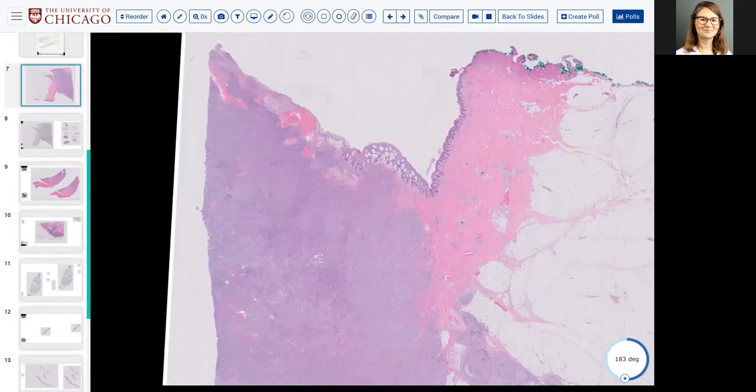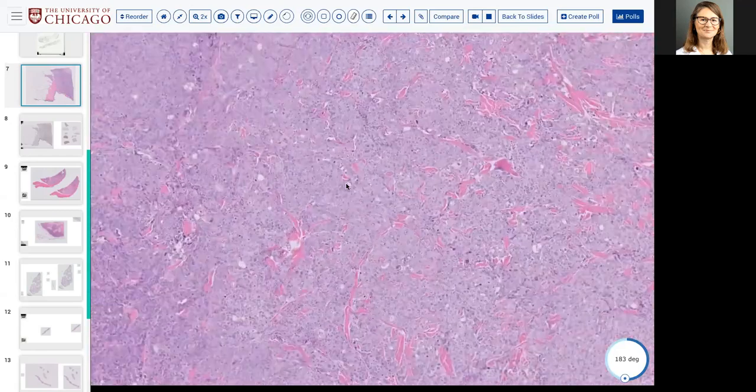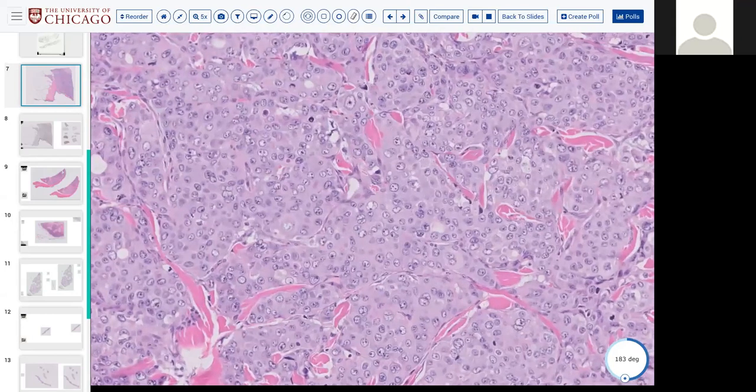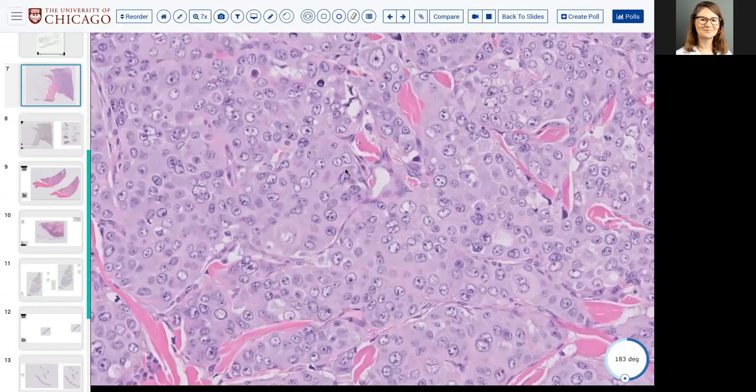Tell me what stains you want, and I'll tell you. We want to do vascular and INI1 and BRG. Okay, so vascular markers are negative, and INI and BRG. Tell me why you want those. Thinking they have loss, extrarenal rhabdoid, but I think also epithelioid sarcoma. Yep. So it kind of looks like both of them. Exactly. So great.